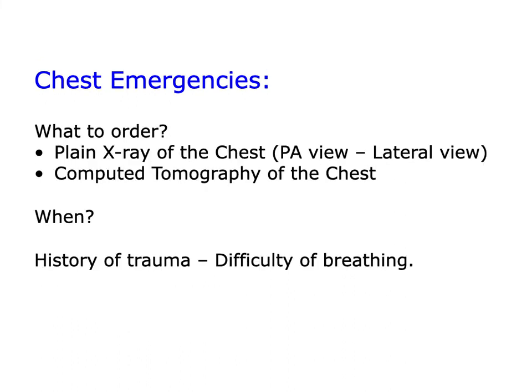So in this case, you have to order a plain chest X-ray, PA and lateral, and the CT scan. Plain chest X-ray in the majority of the cases, and CT scan. If there is any ultrasonographer in your hospital, they have the ability to do a lung scan. They also can do a lung scan in this case, to find pneumothorax or hemothorax or any of these types of complications, depending on the abilities of the ultrasonographer you have in your hospital or your clinic at this moment.